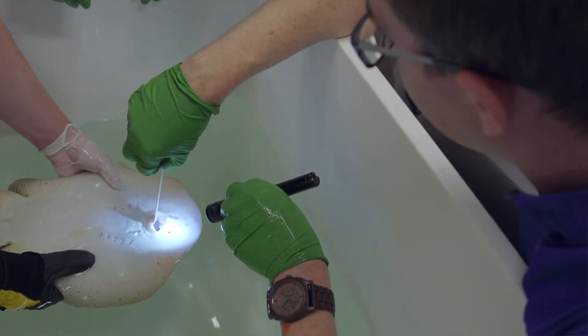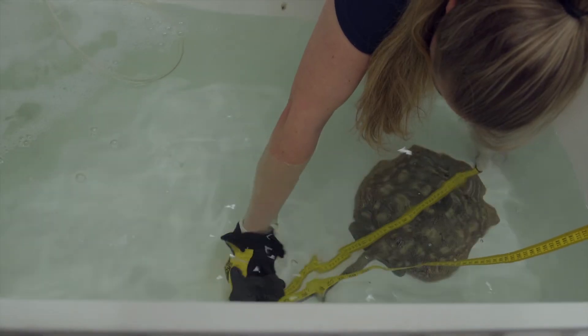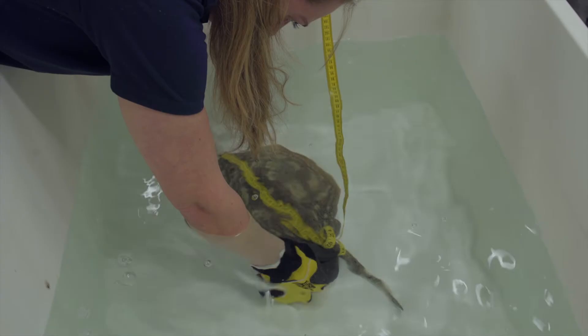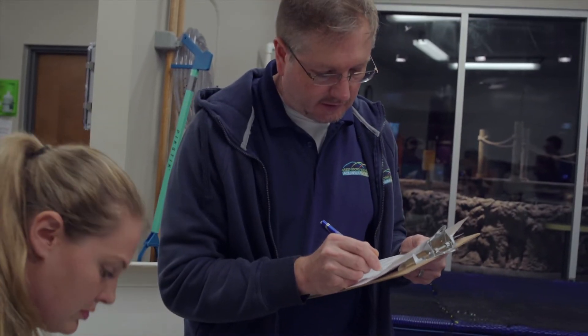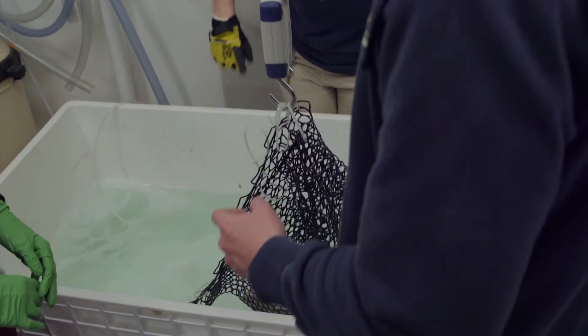At the end, you'll see us taking morphometrics. We measure the total length, which is the body and the tail, the body length — just the body — and then the width, or the disc width.